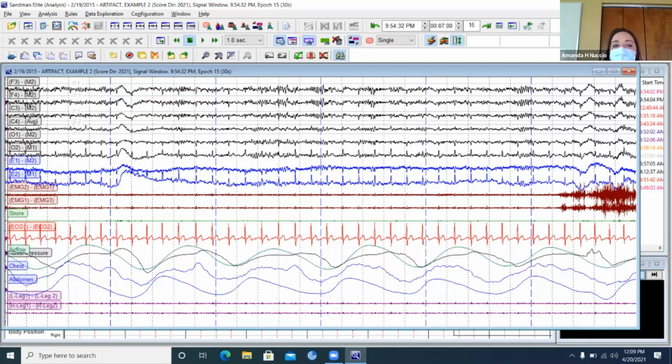The legs are usually pretty easy to see if there's 60 hertz in them because they're either thick or they're not. When they're thin like this, they're good. But when they're thick, like, okay, there's some 60 hertz going on. This is pretty much configuring the montage, what we've been doing, playing out the gain settings, the filter settings.